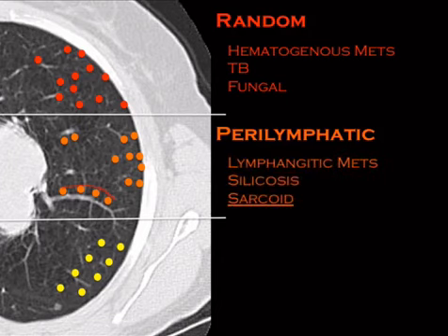Silicosis is the one that confuses a lot of people because they think, well, you're breathing in silica, it should be a centrilobular finding, and it is also. But it's also moved around through the lymphatic system as well, and that would be the trickiest one.